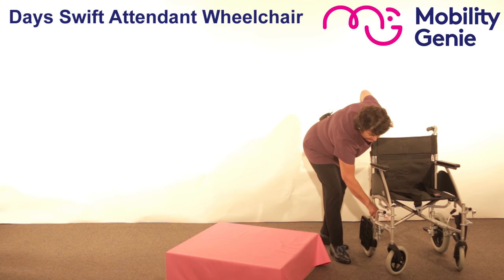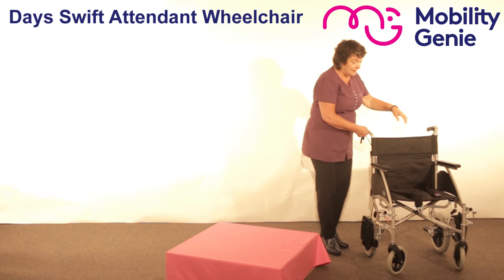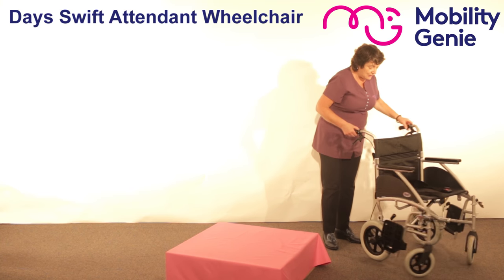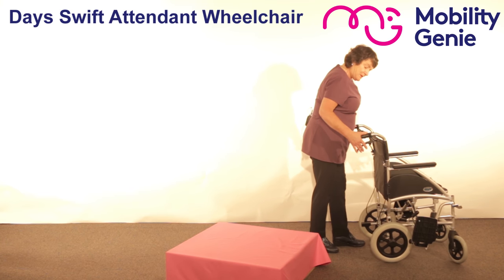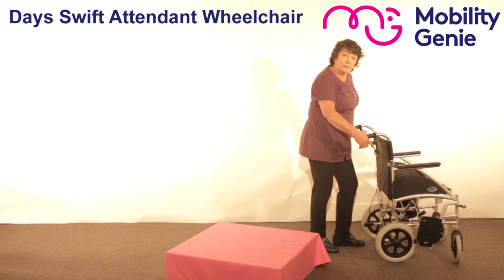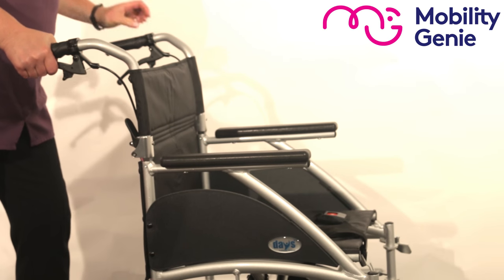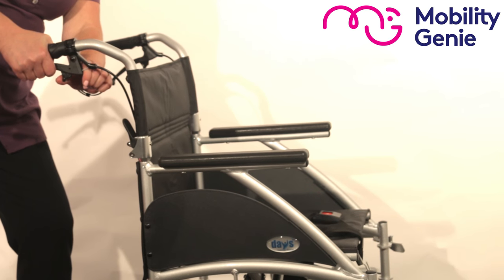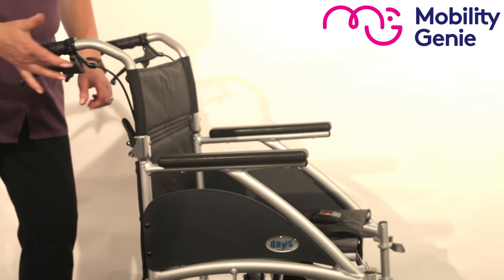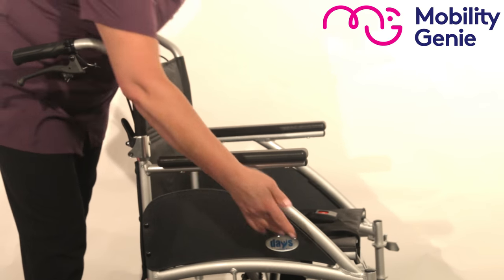You put on both brakes when the person is getting on, and both brakes when the person is getting off. I can slow myself down as I'm walking, but if I want to stop the wheelchair and put on the brakes, you simply pull the brake right up towards you and push this button to the front, and it puts it into a locked position. You can see that at the front of the wheelchair.